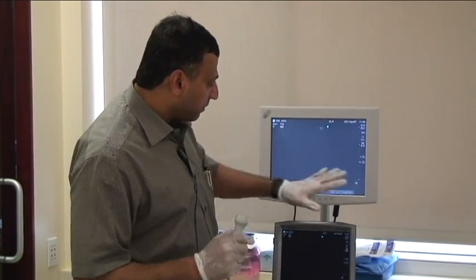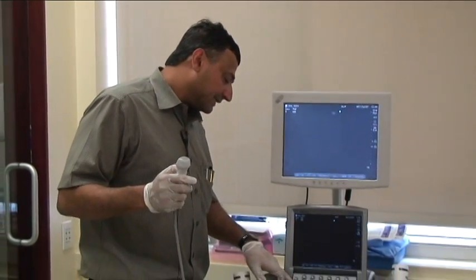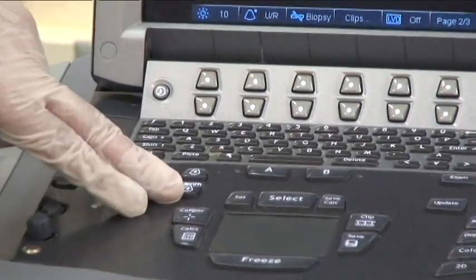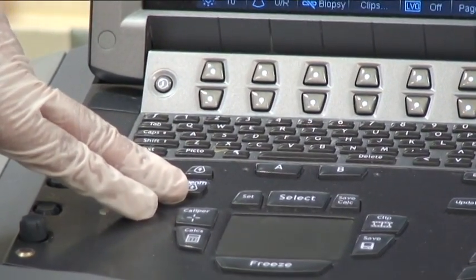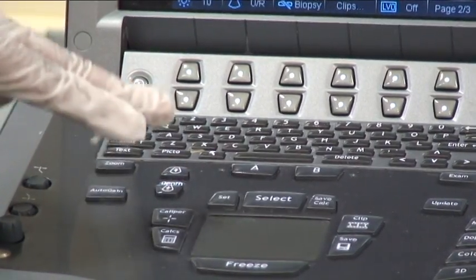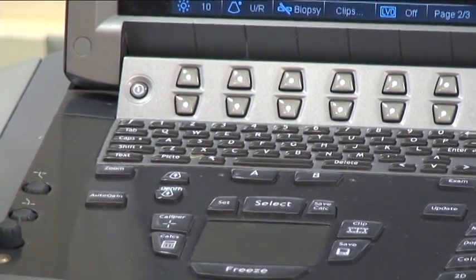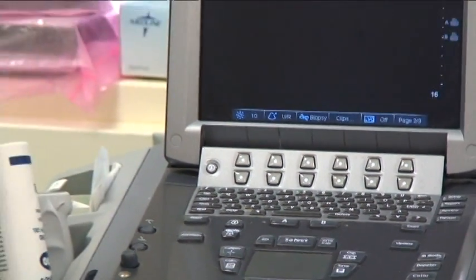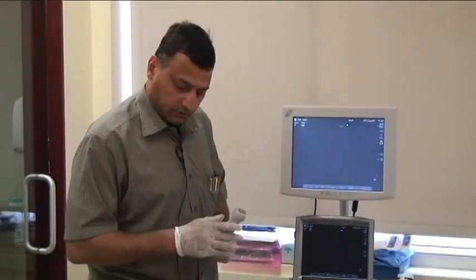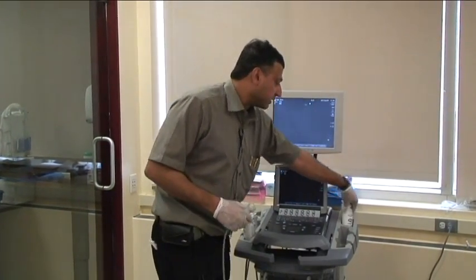Some of the buttons that you would have to be familiar with are the depth button, which is probably going to be the most important thing that you're going to play around with, particularly when you have somebody with an enlarged liver, some ascites, the heart's a little distant away. You'd really have to come down on the down button on the depth so that you get the heart in the appropriate view. Now, the way we're going to do it is we're going to first get the subcostal view of the heart and then slowly rotate and show you what the IVC looks like. So let's just go about it and hope that James has good enough windows.